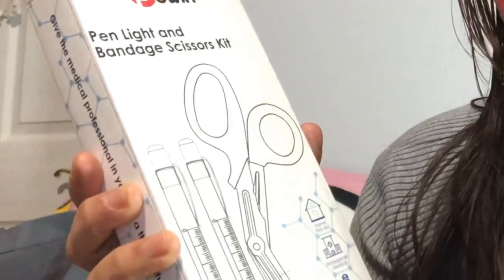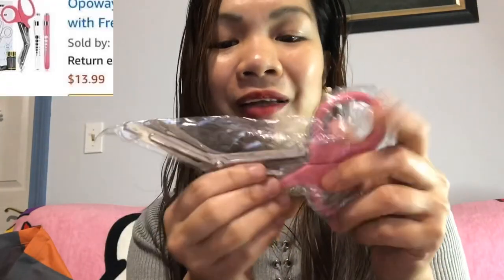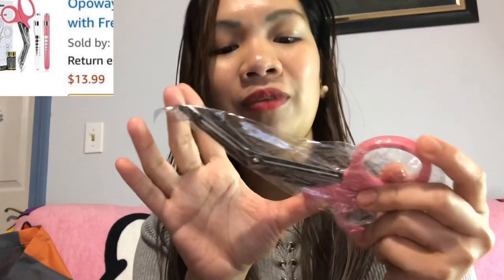The next one is from the Powe brand — it's a pen light and bandage scissors kit. When I got this I was shocked because it's quite big. Usually when I was working in the Philippines, the bandage scissors were not this size — this is a very huge bandage scissor. But it's fine. It's pink again — thank you for the gift! I'm left-handed, but it's still nice. I can just put it in the case.